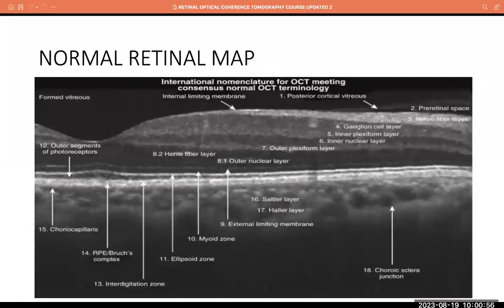So if you write out the regular code we write for the neurosensory retina while learning their layers, it is RPEOOIIGNI. R is the RPE itself, the P is the photoreceptors, the E is the external limiting membrane.